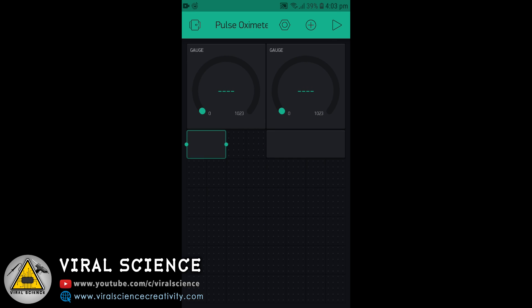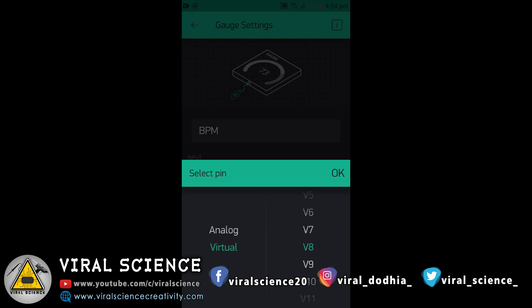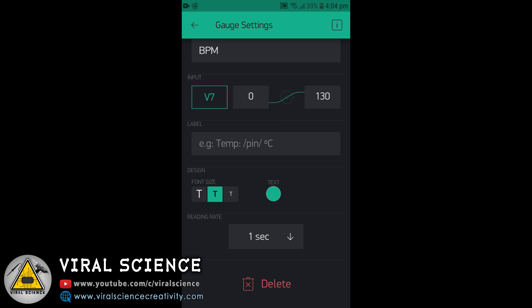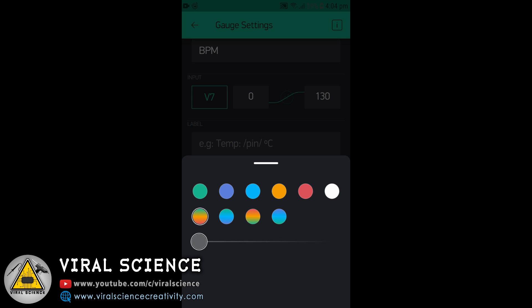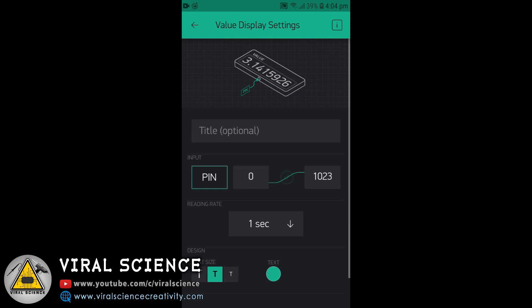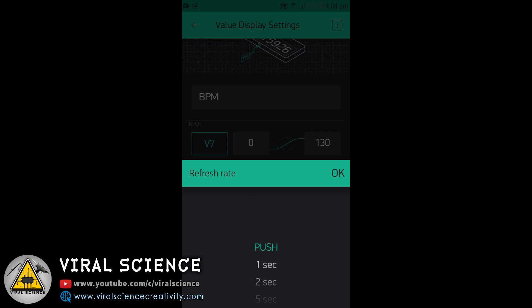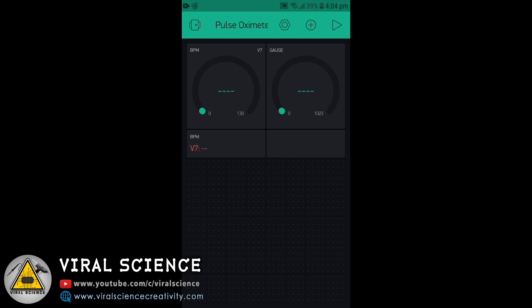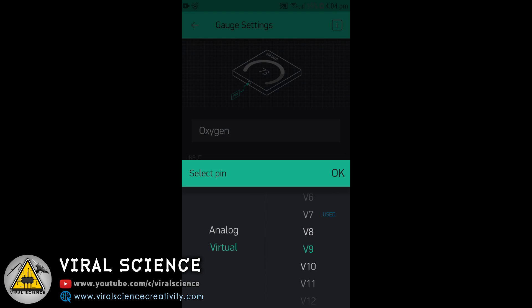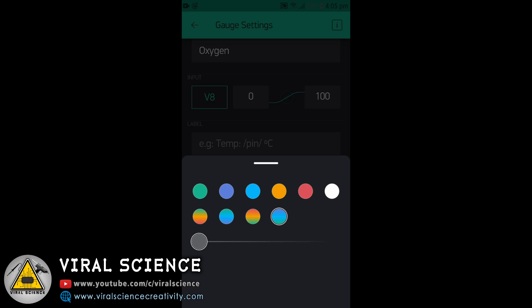One will show you the BPM values and one will show you the oxygen level. We will select virtual pin V7 and set the value from 0 to 130. You can also set the colors for this gauge. Now we will set the other one. We will add the same values in the value display as well. For oxygen, we will select virtual pin V8 and set the values from 0 to 100, give it some color — I am giving blue.